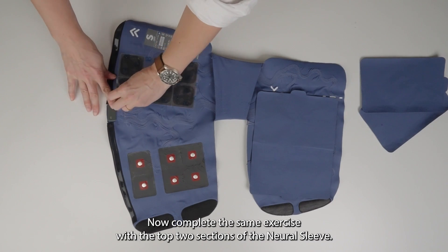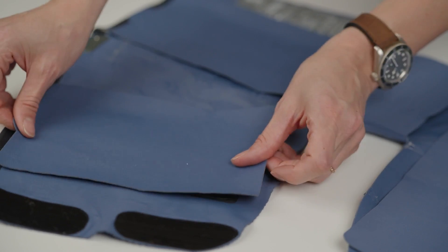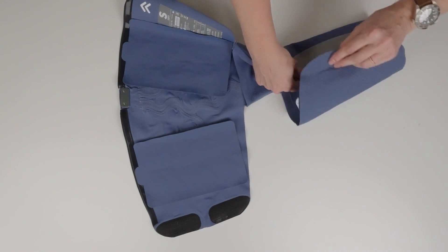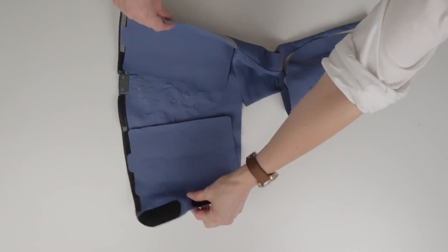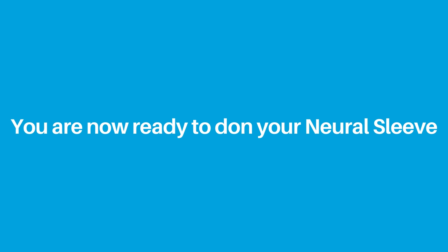Now complete the same exercise with the top two sections of the Neural Sleeve. You are now ready to don your Neural Sleeve.